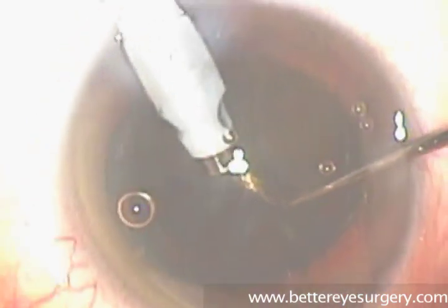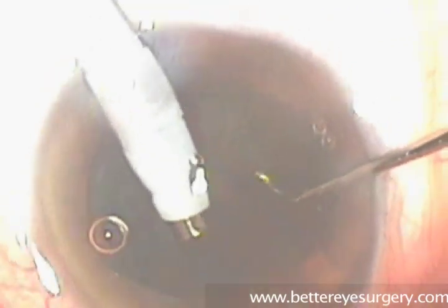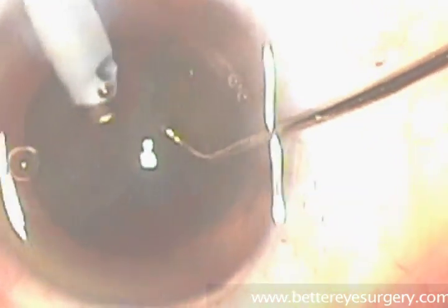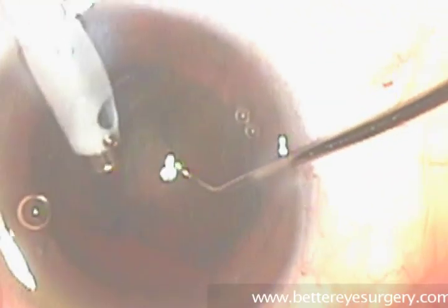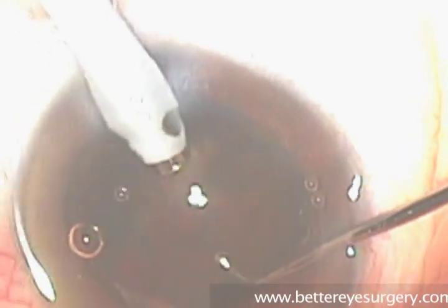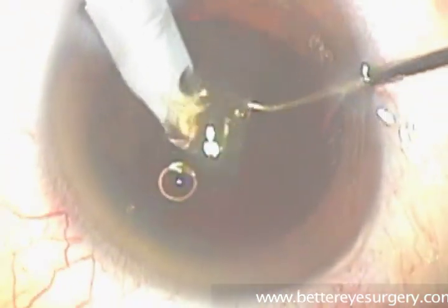Although this video has been edited, we're seeing this lens removal process more or less in real time. As we remove the lens of the eye, we can get a clearer view of the red reflex, or the red light that comes back to us from the microscope light. This is just a reflection from the retina, and we're seeing this now because the cloudy cataract, which is being removed bit by bit, allows light to pass through the eye more clearly.